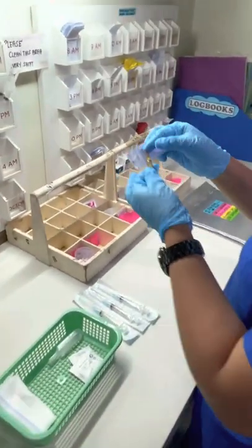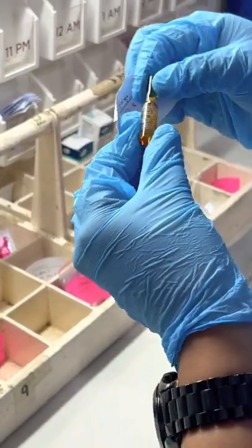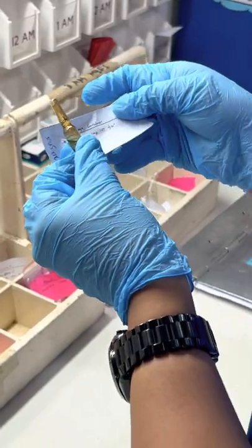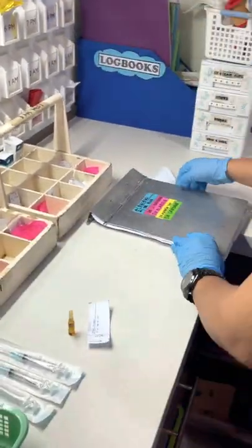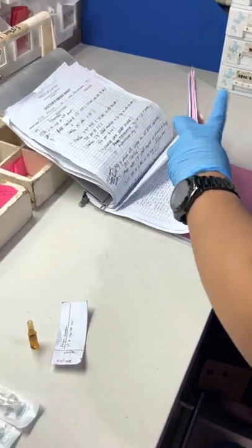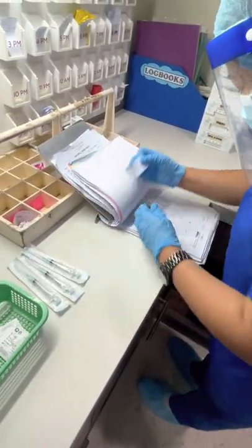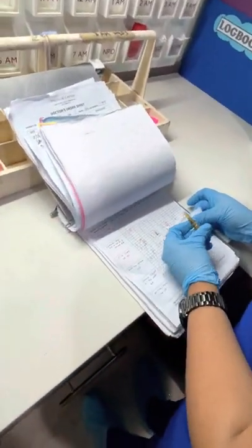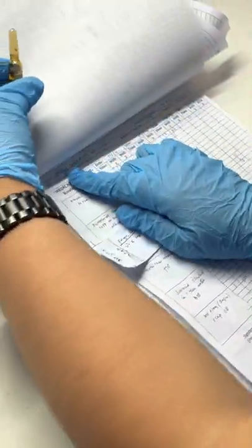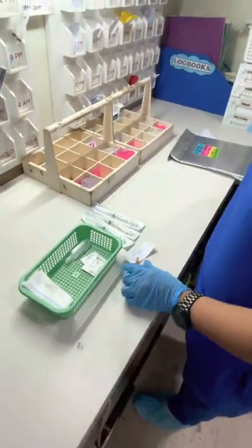Hello everyone. We will be preparing medications inside an ampoule and administering it through IVTT to our patients. First, you have to check the label and check it together with the ticket — that is one of our policy and protocol here in the hospital. Make sure that you flip to the medication administration record, that is your MARS sheet in the chart, and check that everything written in the ticket, the MARS, and the label on the ampoule all match.